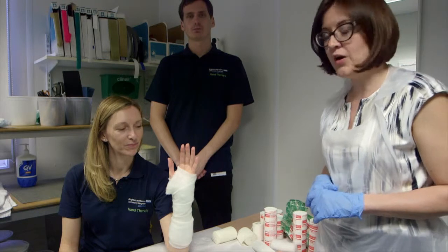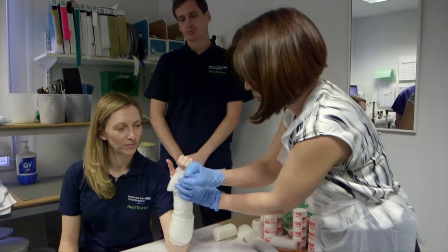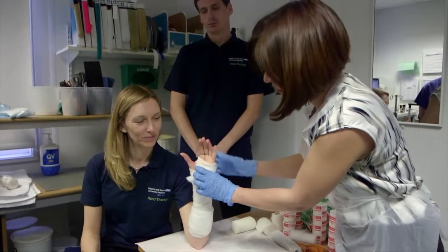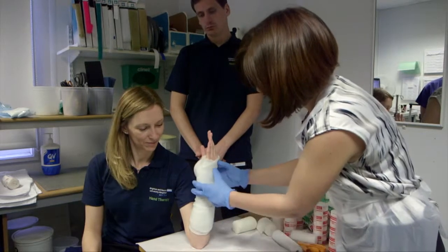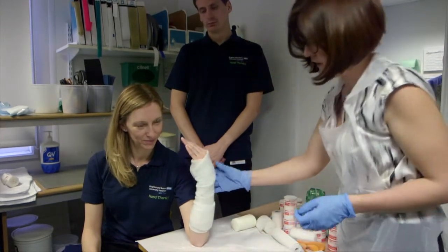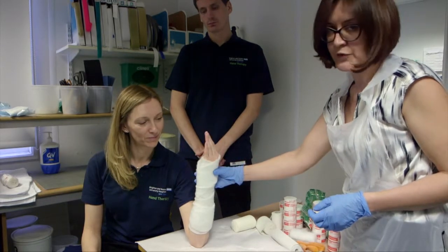The important things to take home are the ability to see the MCP joints so the patient can make a full fist in the plaster. Likewise the thumb base must also be free and alignment must be neutral. Bending the wrist does not affect the fracture and does not help to reduce the fracture and can cause stiffness. The wrist must be in neutral.